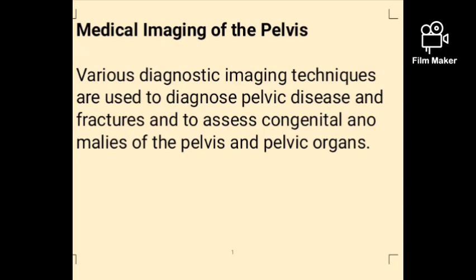The topic is medical imaging of the pelvis. How does the pelvis look under radiological examination? You need to understand the anatomy of the pelvis under radiological examination. Various diagnostic imaging techniques are used to diagnose pelvic disease and fractures. These imaging modalities are also used to assess congenital anomalies of the pelvis and pelvic organs.